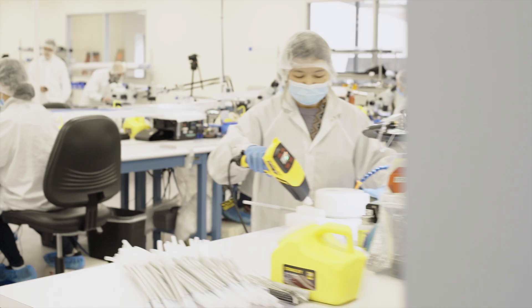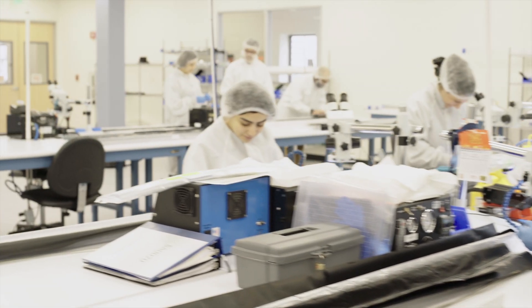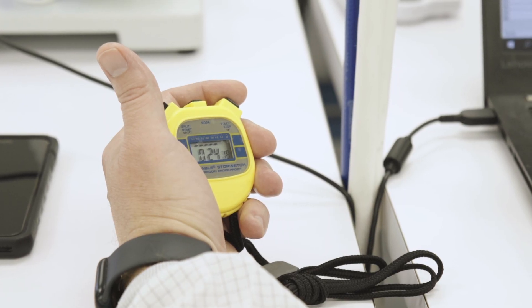To put our multi-lumen liner to the test, we enlisted the help of a catheter manufacturer and four operators of varying skill levels. The operators built two sets of four-way steerable catheter shafts, and the time to complete each step was recorded.